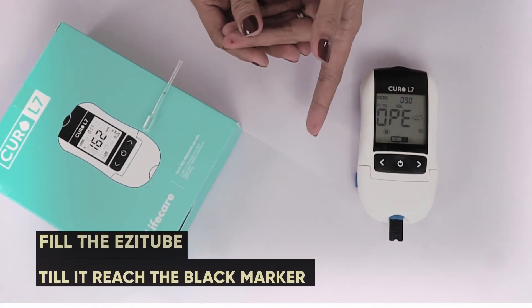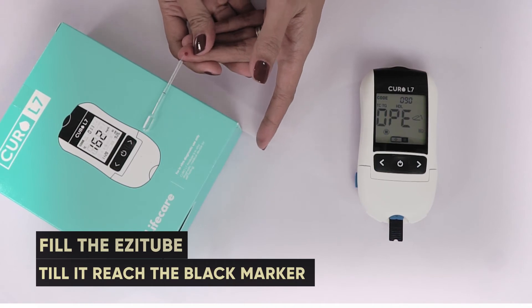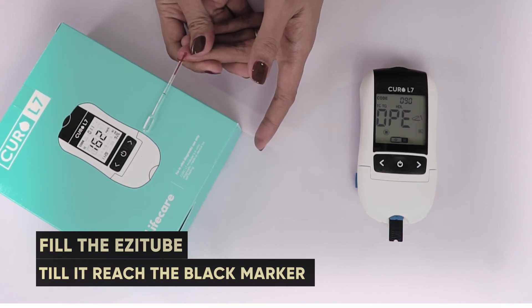Then place your finger near the opening of the easy tube. Squeeze gently and let blood fill the easy tube until it reaches the black line, which indicates you've extracted enough blood.